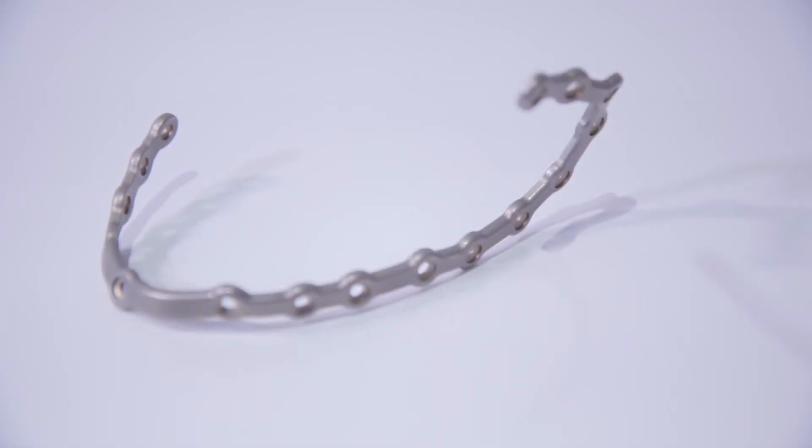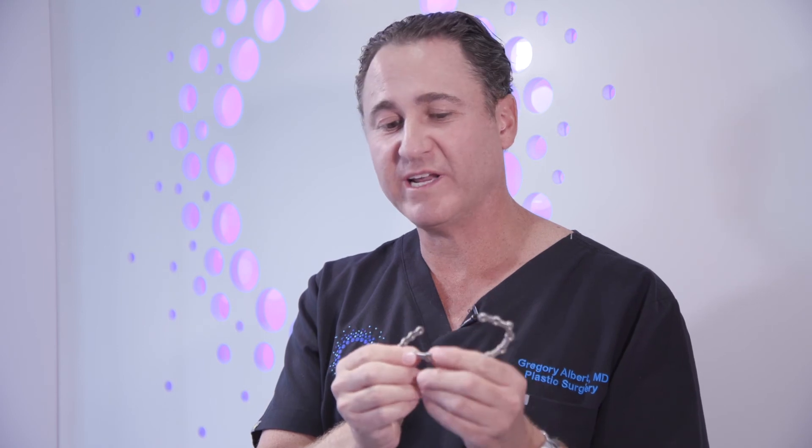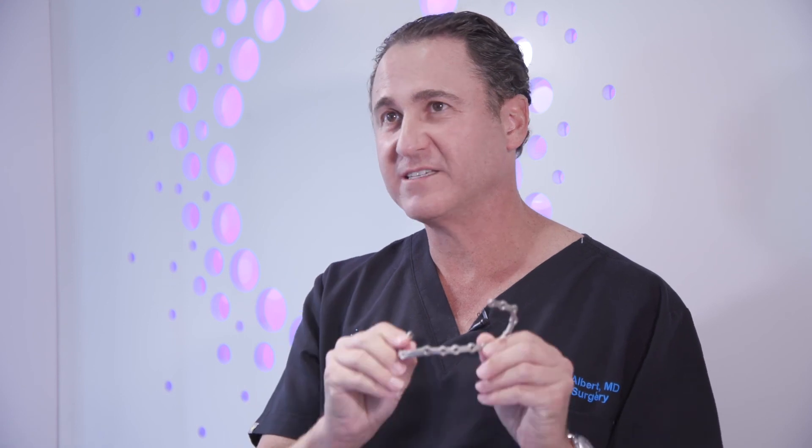For jaw fractures, a mandible plate is used. As you can see, the metal is thicker and the screw holes are larger. It's important to get the mandible in just the right place, because it has a lot of important functions like eating and talking. There are lots of muscles that can move the bones around, so it really needs that extra fixation and strength to the bone.